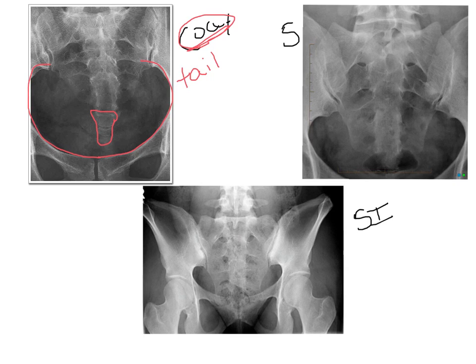Okay, so because we've angled the tube, the type of distortion we are seeing is shape distortion. And what we have actually done is foreshortened the sacrum so that we project this coccyx into the pelvic brim. When we do that, we foreshorten the sacrum to project our coccyx into the brim. We also make the brim appear elongated. The brim is important to evaluate because this is going to be how we look at rotation. Is the coccyx equidistant from its borders to the lateral margins of the pelvic brim?